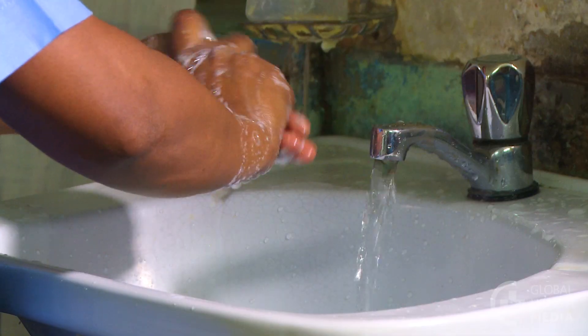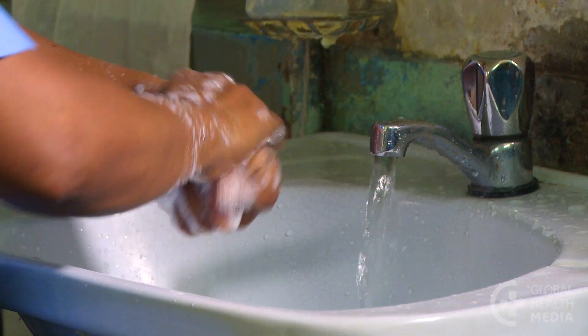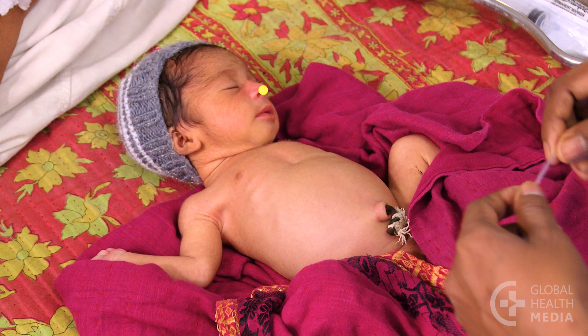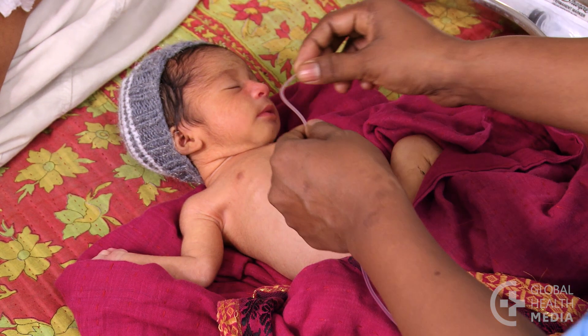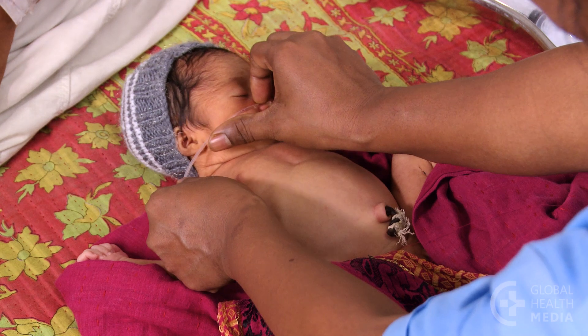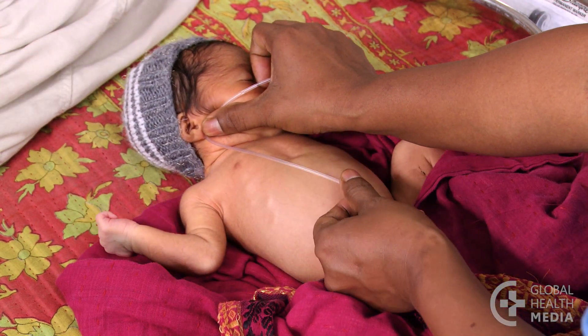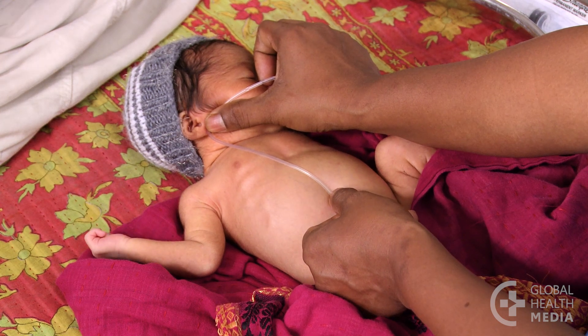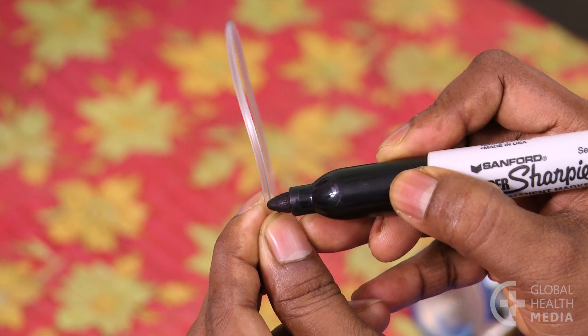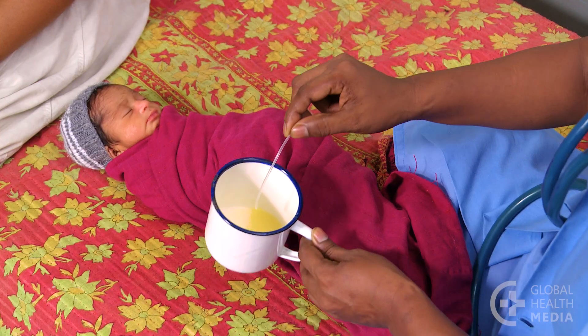Wash your hands well with soap and water. Next, measure the length of tube to be inserted: it goes from the tip of the nose to the earlobe, to a point halfway between the tip of the breastbone and the umbilicus. Put the end of the tube on the tip of the baby's nose, stretch it to the earlobe, then to the halfway point, and mark the length.